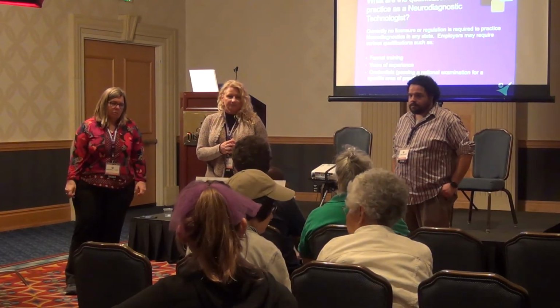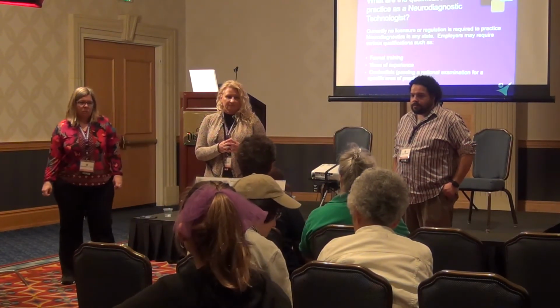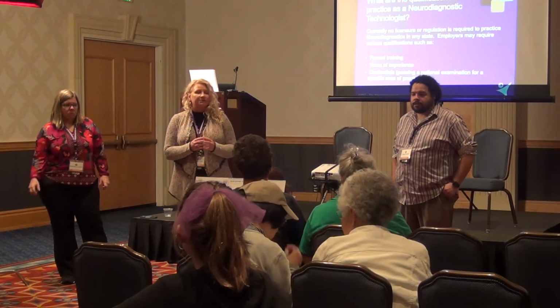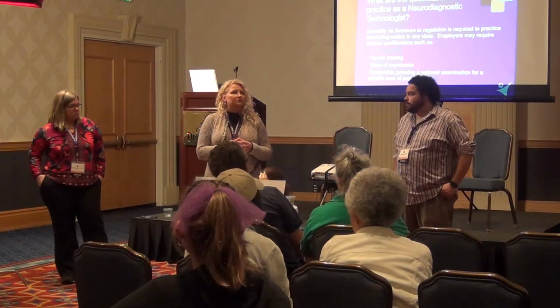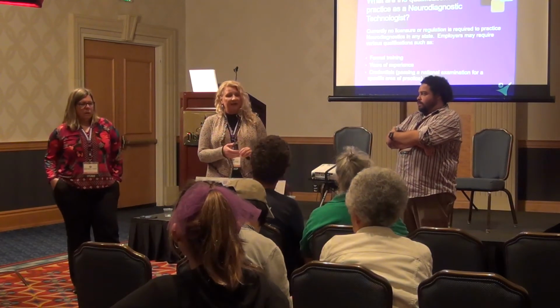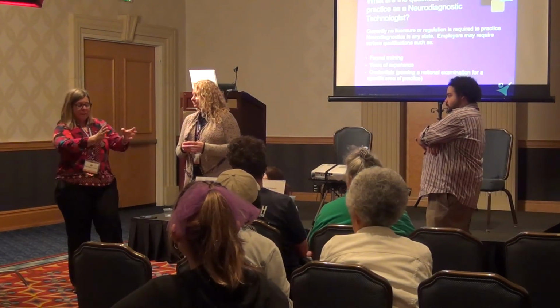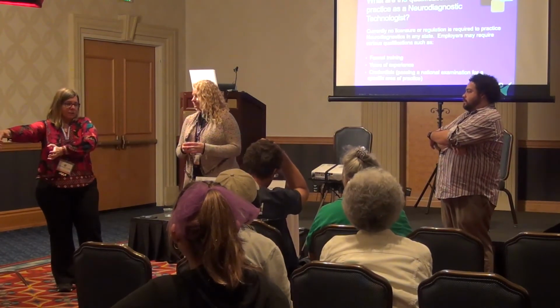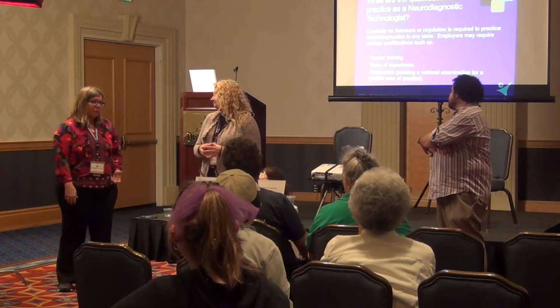I just want to ask, because I wasn't sure of your answer, is it possible to do both tests at the same time during one night? It can be. It depends on where you're at and what your physician would like. It's possible. You may have some limitations depending on which procedure is going to carry the most weight. The way sleep recording is done is different; a sleep system runs and operates differently than an EEG system. That's why typically you don't do both at the same time. It depends on where you are.